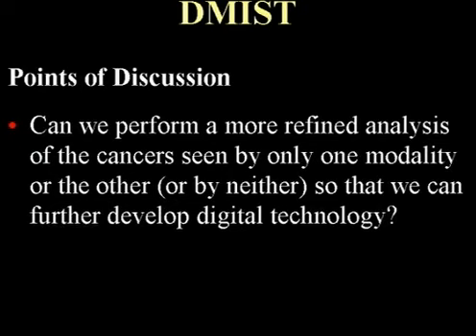But most importantly, think back to that Lewin study when I asked you to remember that 10 of the cancers were diagnosed only on film screen and 9 of them only on digital, with 12 being diagnosed by both. Can we perform a more refined analysis of the cancers that were diagnosed only on one modality or the other? If so, we might be able to improve digital technology.